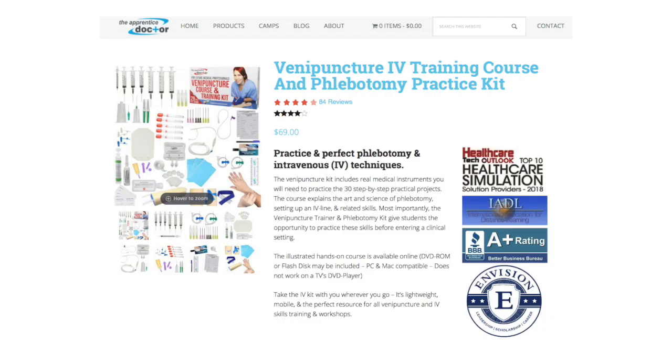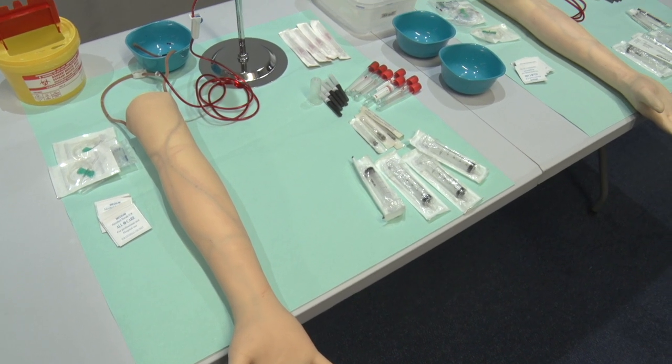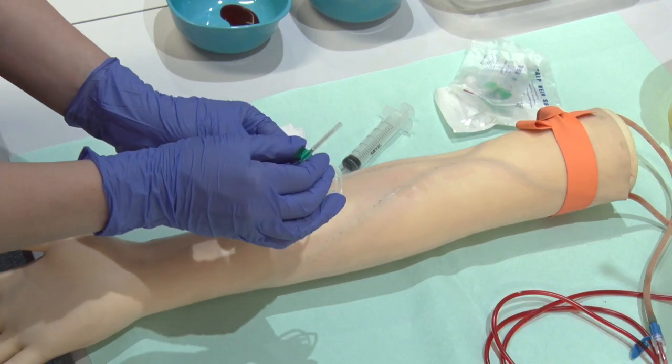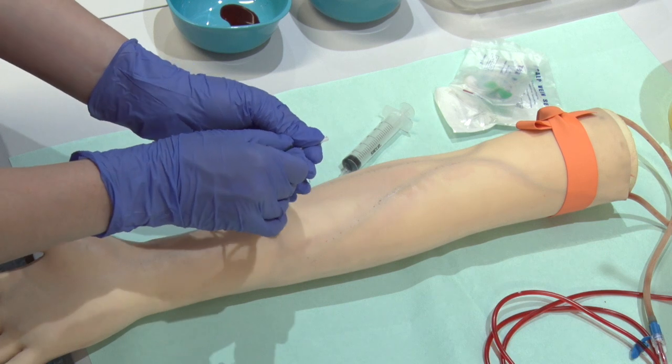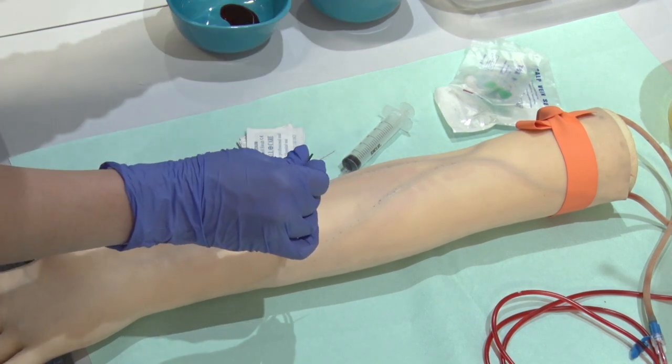The Apprentice Doctor Venipuncture Workshop, Venipuncture Course, and associated Venipuncture Kit and items like the Apprentice Doctor Simulation Phlebotomy Practice Mini or Anatomic Arm are ideal resources for teaching students the various injection, phlebotomy, IV, and associated skills.